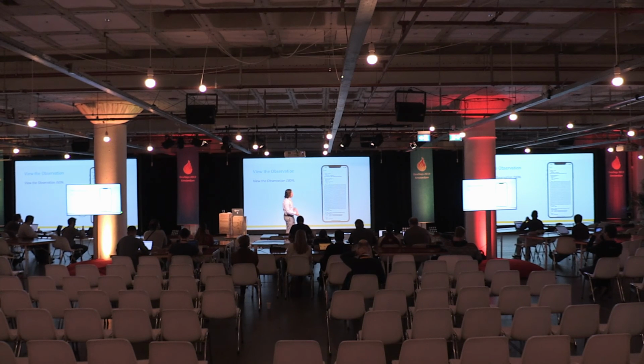And so if you're here for the previous session, you'll see that it created an observation with value sample data here, and the heart rate value is somewhere in the sea of E's. So again, if you're using a device that outputs measurements at a high frequency, these will be filled up more. And in fact, you can go back into the Apple Health app and add more heart rate data, and it'll start filling in this observation, or you can select a different hour, and you can create more observations for different hours.